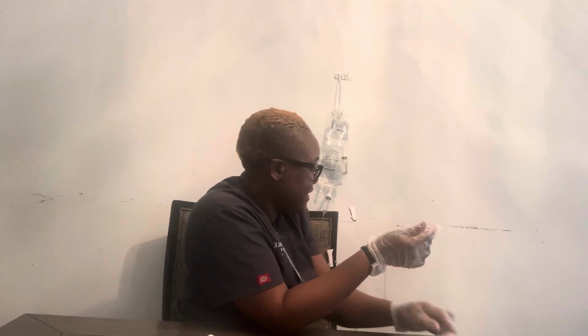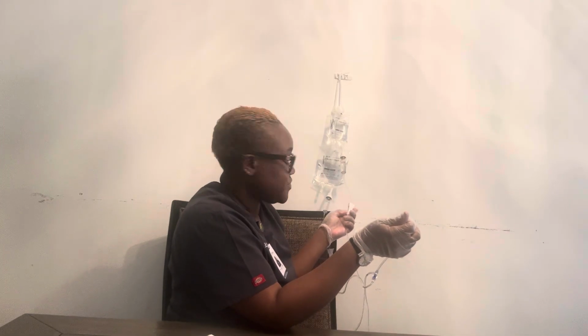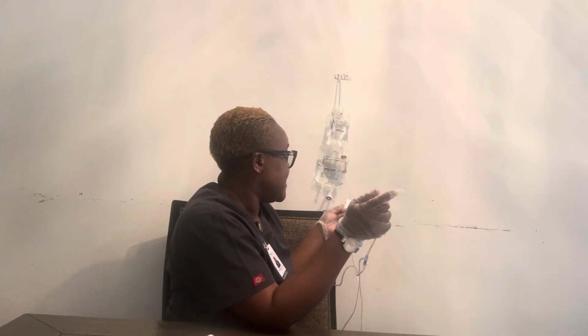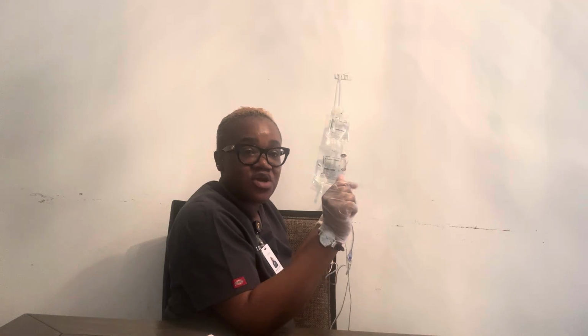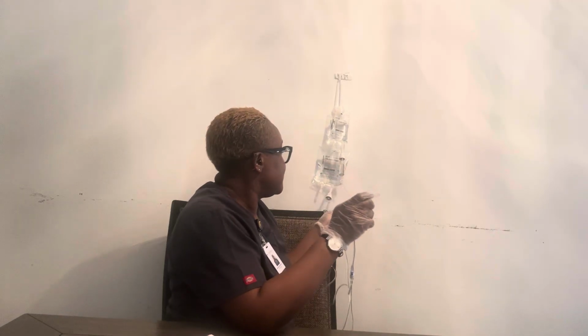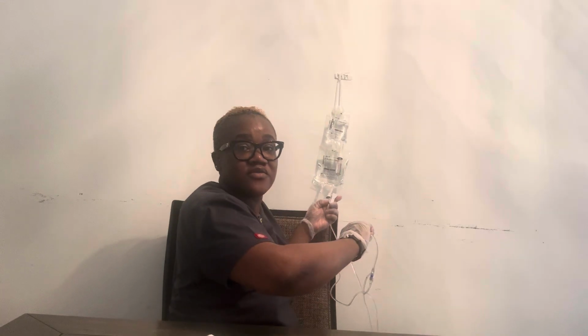Okay, so now that I've done that, I'm gonna open the roller clamp to my medication, slowly open it, and then I'm gonna count my drip rate, and I am supposed to have 133 drops per minute. So I'm gonna go ahead, slowly open, and then count for 1 full minute.